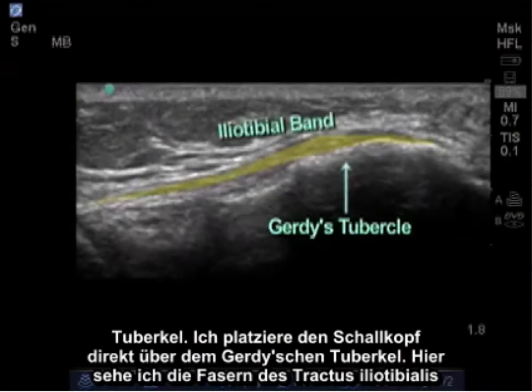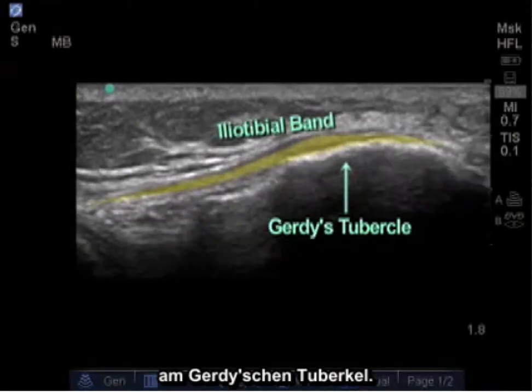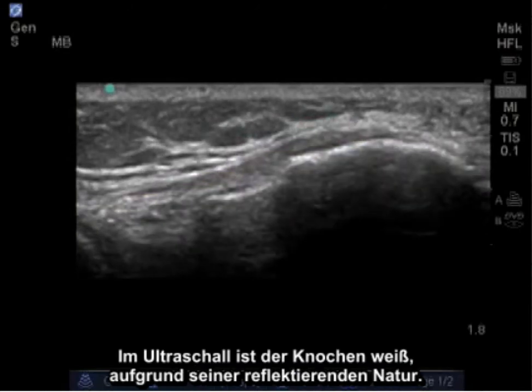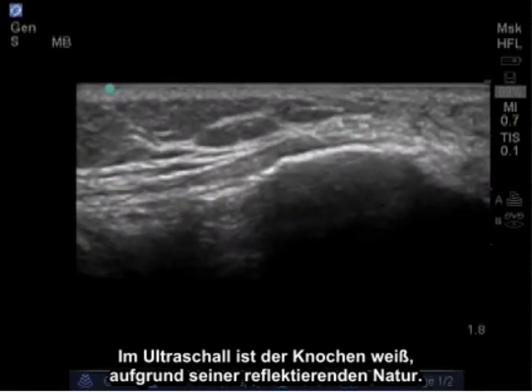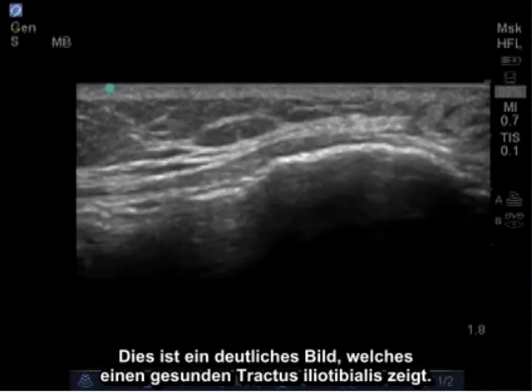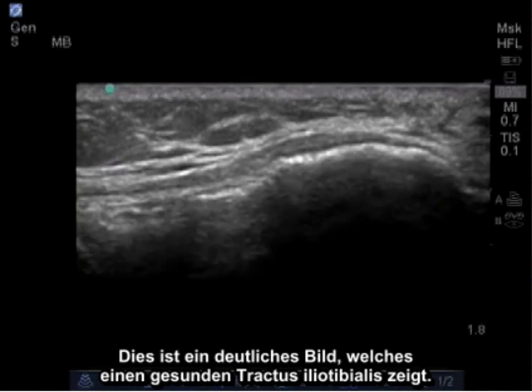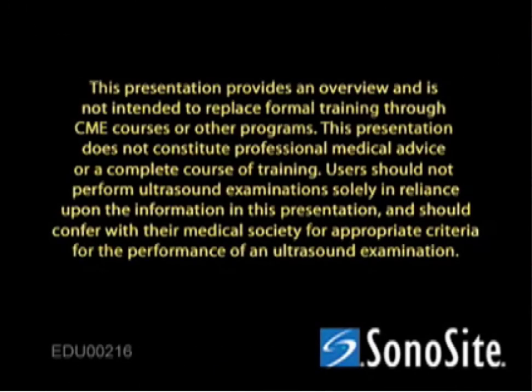Here I see the fibers of the iliotibial band attaching on Gerdy's tubercle. In ultrasound, bone is bright white due to its reflective nature. This is a clear image showing a healthy iliotibial band.